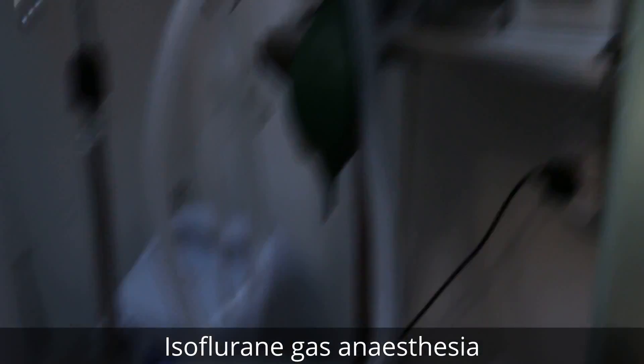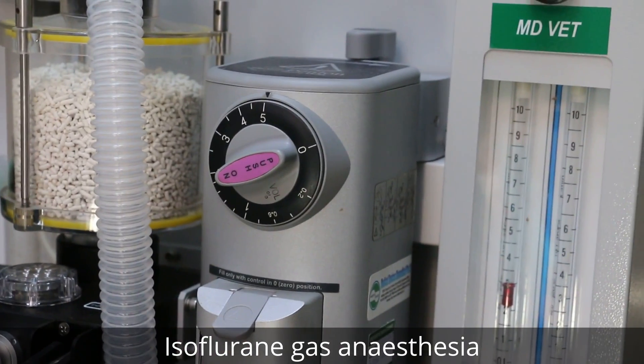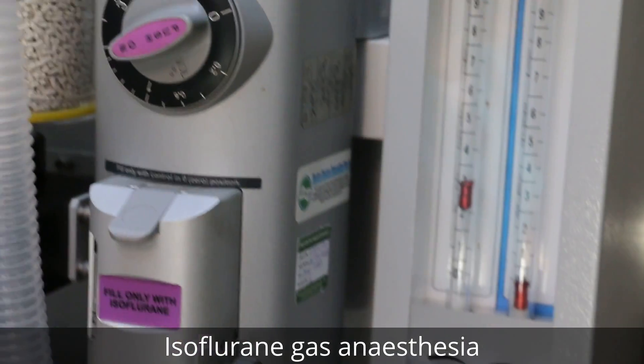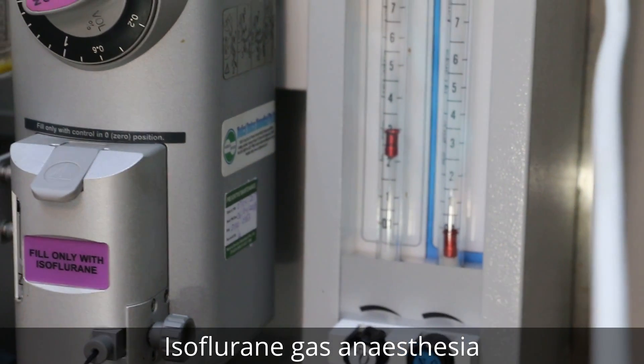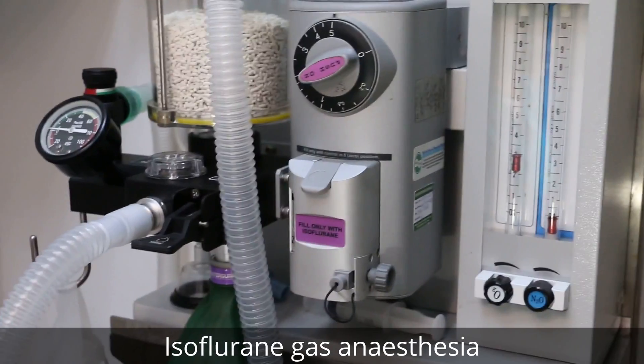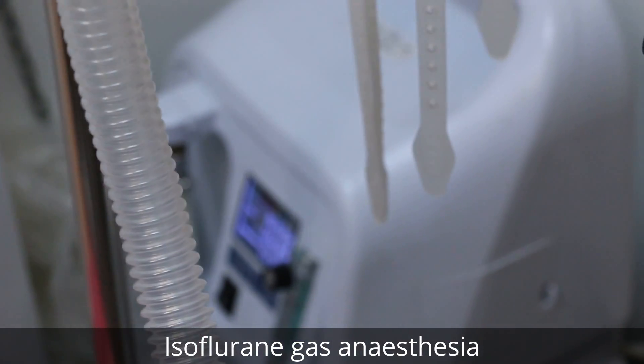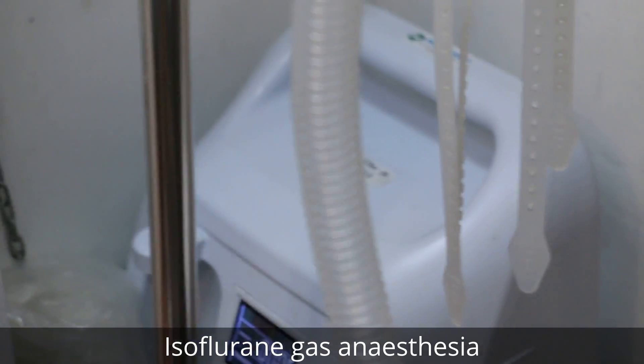Now we put on the gas. We have to do 5% plus four liters per minute. Oxygen and isoflurane will do it.